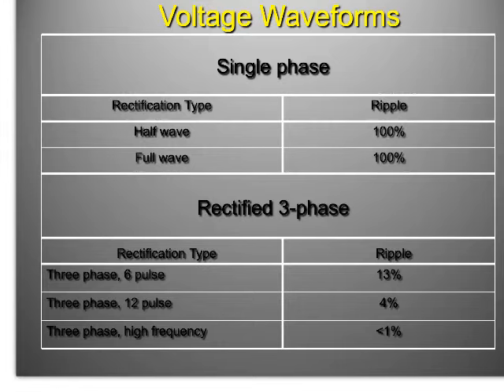So when I asked you, what is the frequency of power in the United States of America, and we said it is 60 hertz, that means it has 60 cycles per second. Okay? 60 cycles per second. And each cycle, we've said, looks like this. It's an alternating waveform. I slightly misdrew that. Just a sec. Let me draw it right, because this is important. So that would be one cycle of alternating current, and we said that there is 60 hertz. That means there's 60 of these cycles every second in U.S.